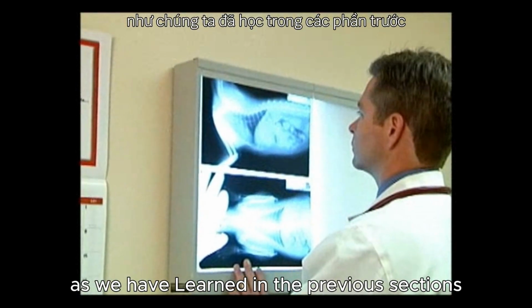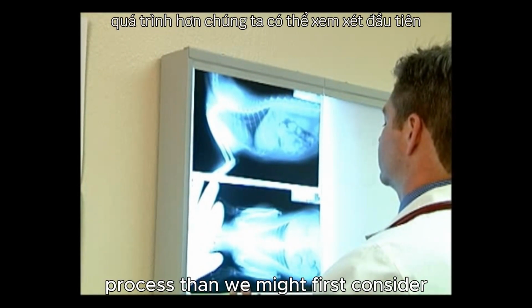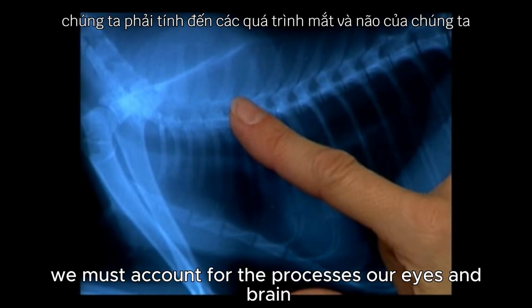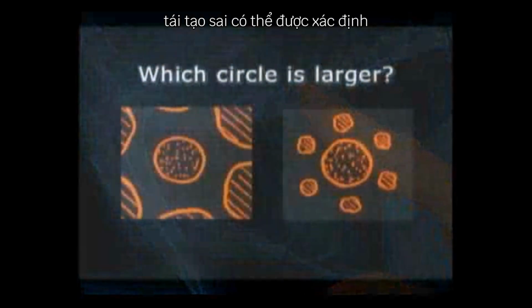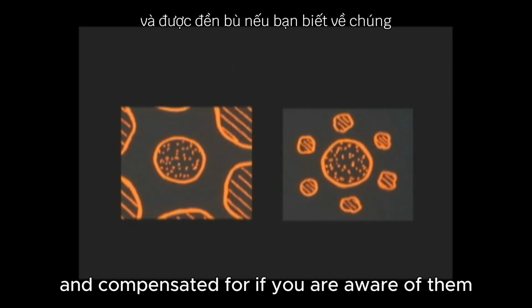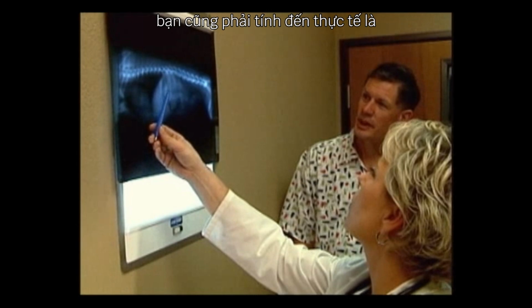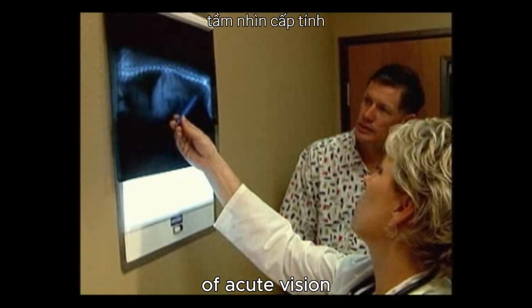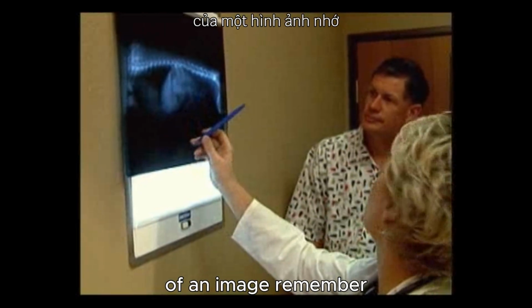As we have learned in the previous sections, interpreting radiographs is a much more complex process than we might first consider. We must account for the processes our eyes and brain use to reconstruct images in our mind's eye. False reconstructions can be identified and compensated for if you are aware of them and train your eyes and brain appropriately. You must also account for the fact that our eyes have a limited area of acute vision, and we must be very thorough in looking at every area of an image.